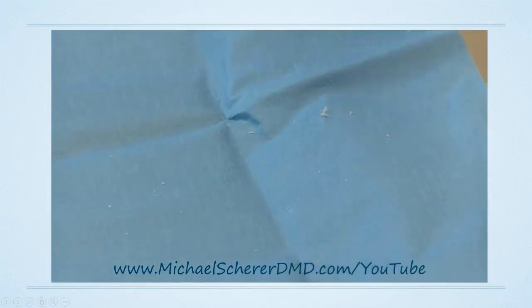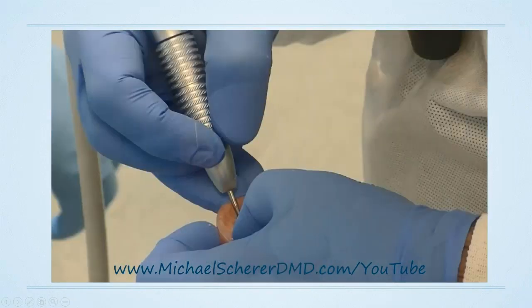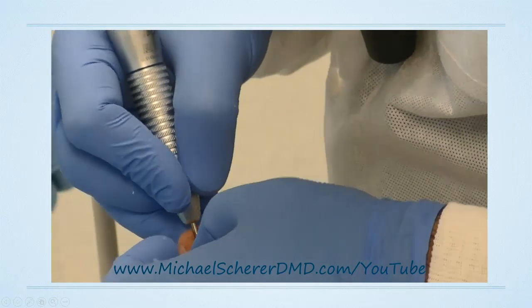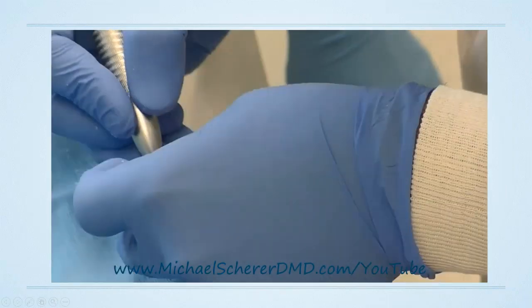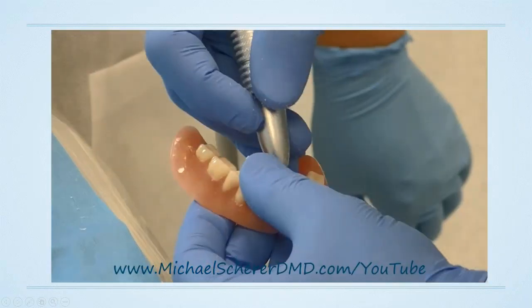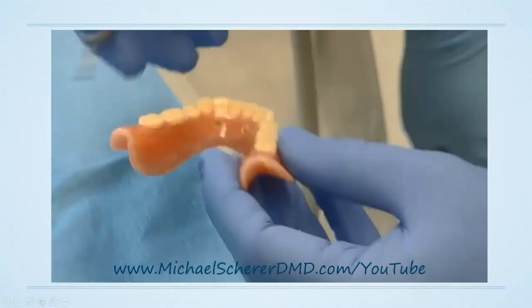Then I'm going to drill a hole through the lingual or the palatal of the patient's denture. It'll show it right here. As I'm drilling a hole through the palatal or the lingual aspect of the denture, it's going to create what's called a vent hole. The vent hole is going to allow for excess material to flow. Drilling through the buccal or the lingual, depending upon which is the most thin. You can see here I've got a couple of holes that go right into where my recesses are.